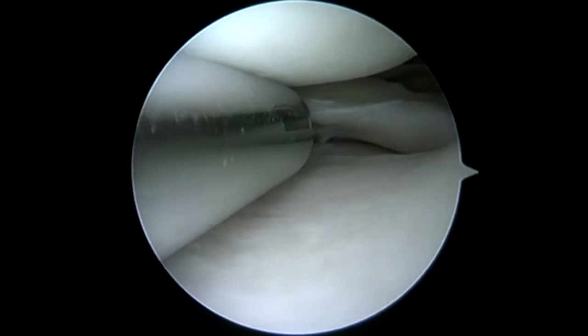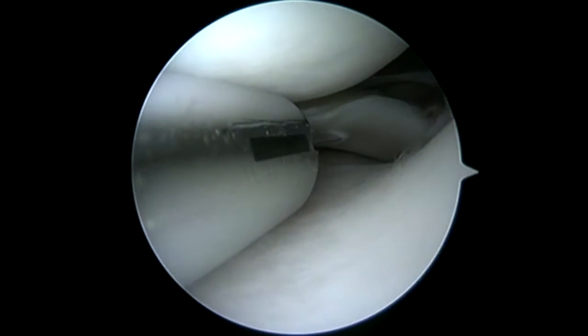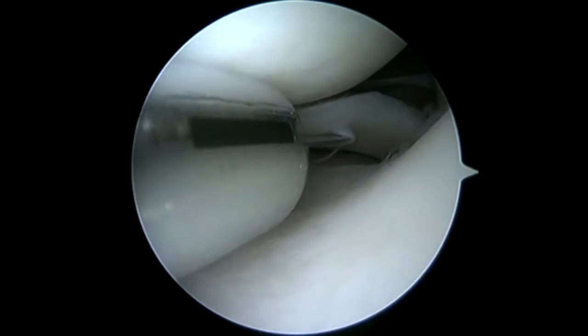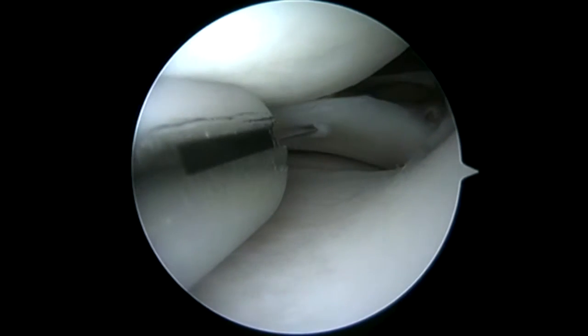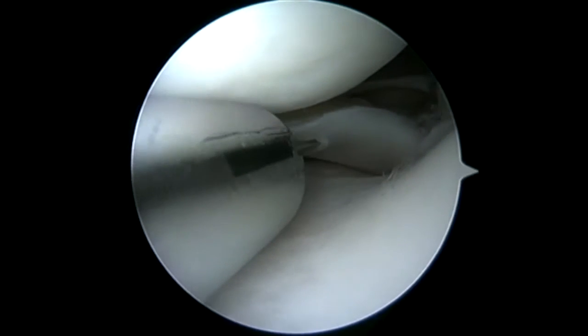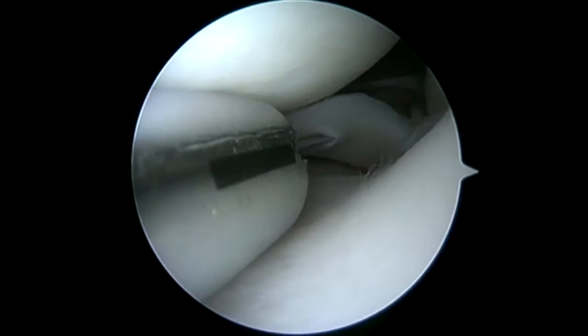Here I've cut the first set of sutures, and then I'm going to open the tibial lamina of this posterior horn and see if I can grasp and retrieve it. Now you have two options when retrieving implants: you can either push them back out through the capsule or bring them out through the portal. If you can successfully and easily get to them without tearing up the meniscus, go ahead and bring them out through the portal. However, if you can't, you can push them through the capsule and out the back. Once they're out the back, they should be fine.